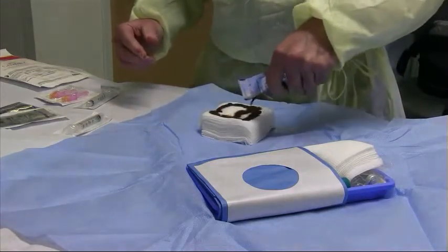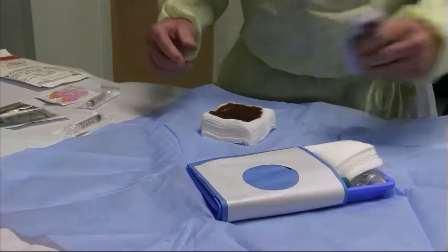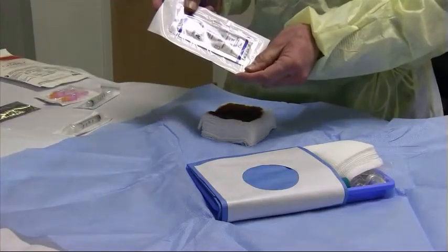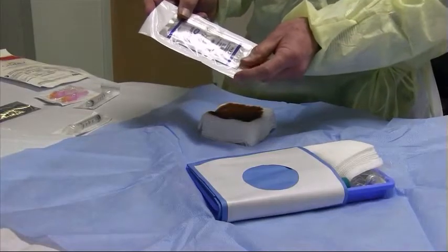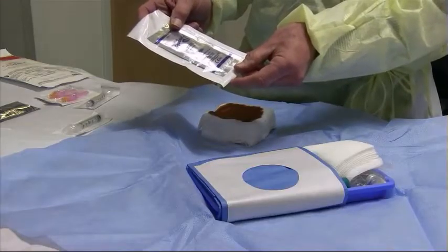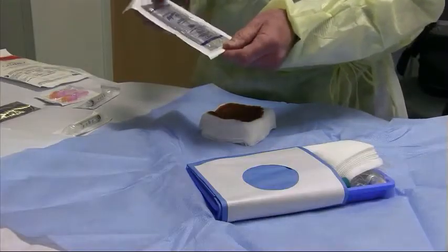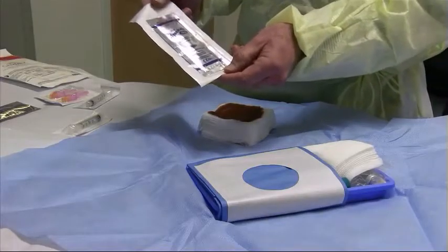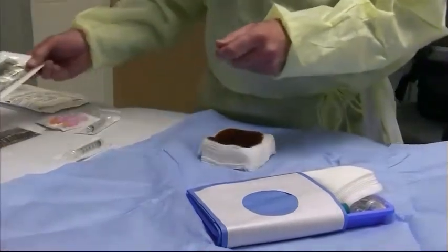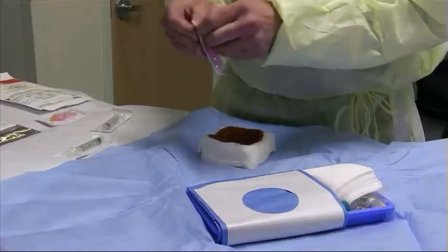We will also be using betadine in the procedure. I soak these four by fours with the betadine — this is to clean the patient and also the probe once we do the procedure. You could use sterile gel during the procedure, which comes pre-packaged. Some attendings prefer to use this, but I actually just use betadine on the probe and the patient, which acts as a good acoustic window. Some attendings will want you to use gel, which is sterile in these packets.